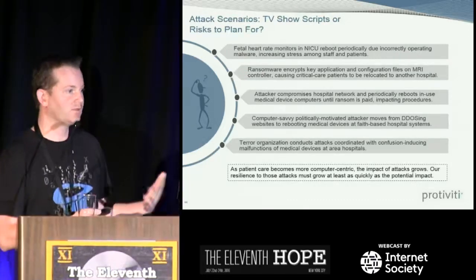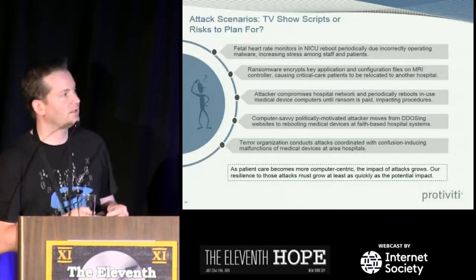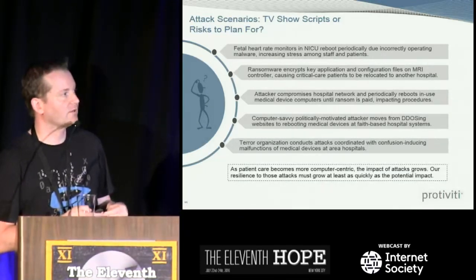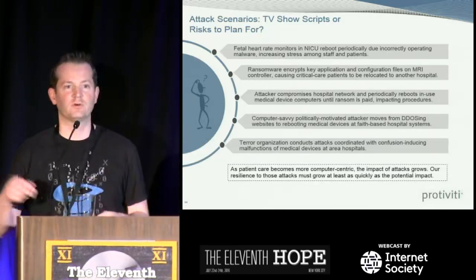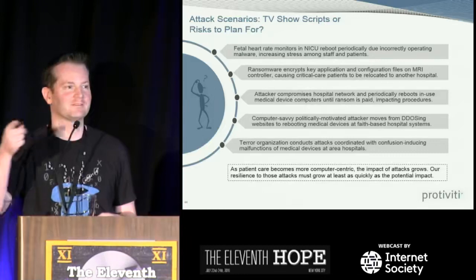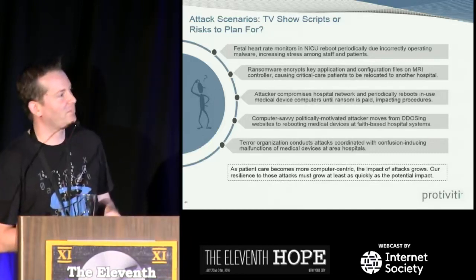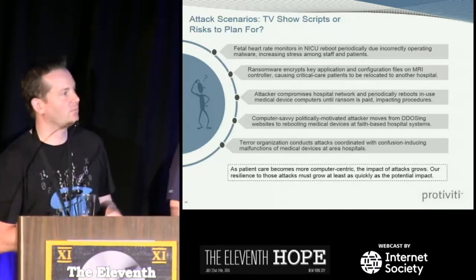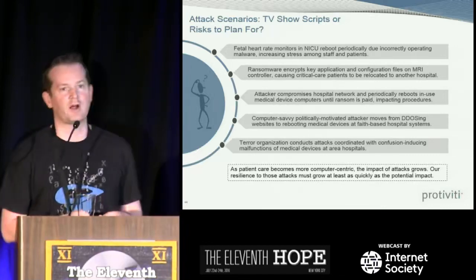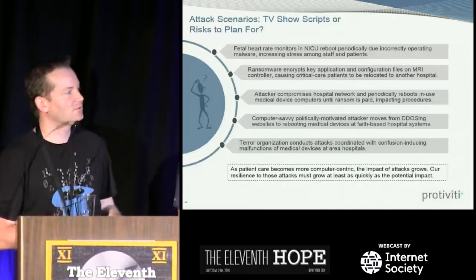If you can't explore it, then you can't make a decision. So here's an example of one. Fetal heart rate monitors in a NICU reboot periodically due to incorrectly operating malware, increasing stress among staff and patients. So is this real or TV show? Anyone want to guess? Real, right? Ransomware encrypts key application and configuration files on an MRI controller, causing critical care patients to be relocated to another hospital. I don't know of that exact case, but you can certainly foresee that.